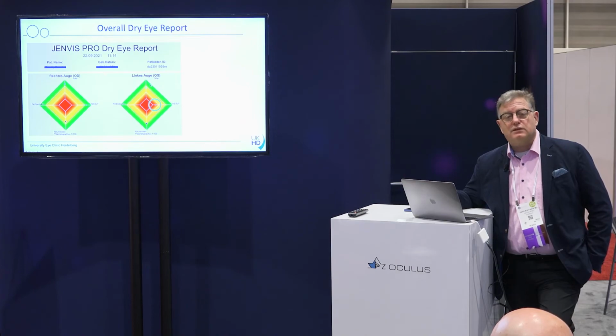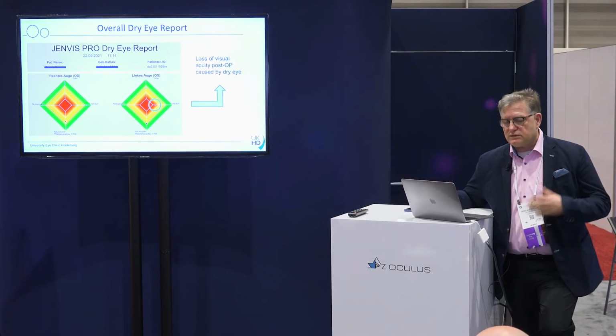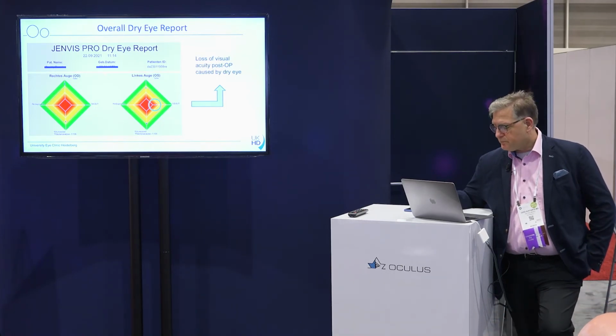So you wouldn't just treat now, you would treat the patient just for the dry eye and then you will be fine with the visual outcome. You don't need to look for cystic macular edema or whatever, all kinds of stuff. It's very easy to differentiate.